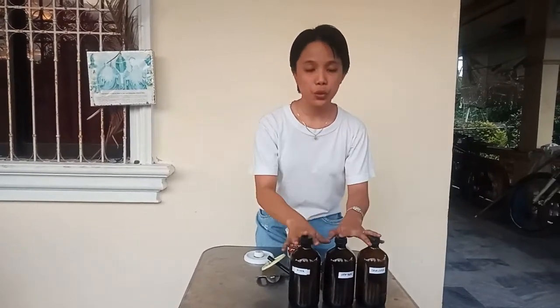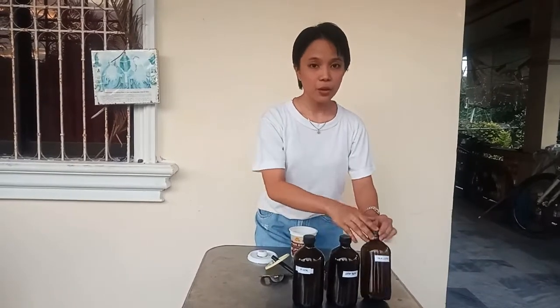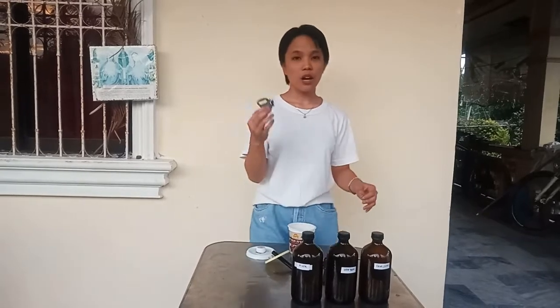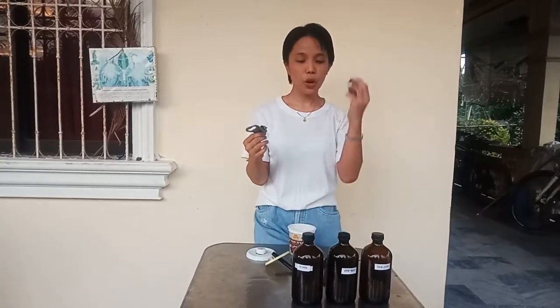And we have the Developer. These are the chemicals we will use in the tank method: the Developer, the Stop Bath, and the Fixer. And also, we use the Film Opener to open the canister to get the film. Actually, we don't have a Film Opener but we can also use the Can Opener.